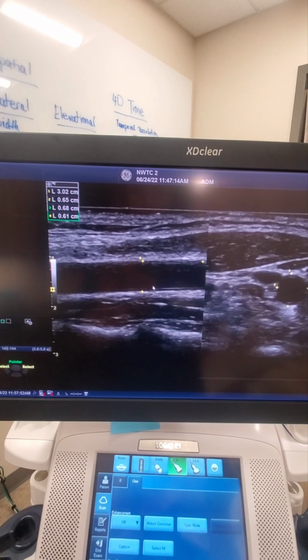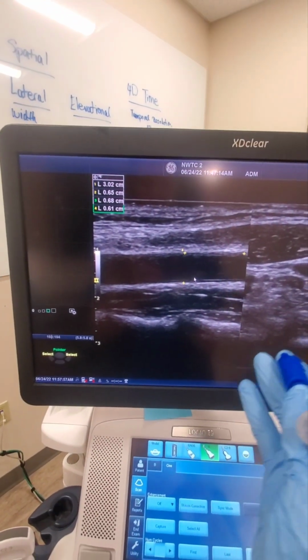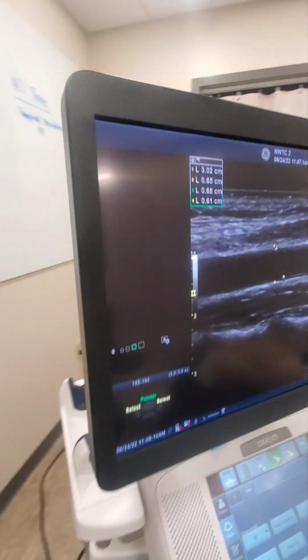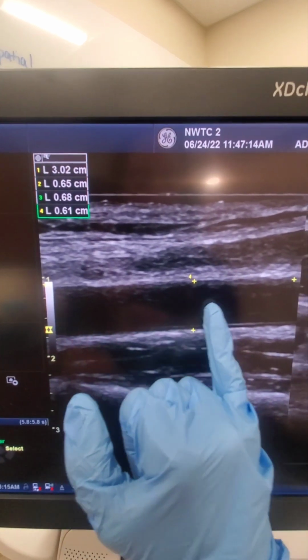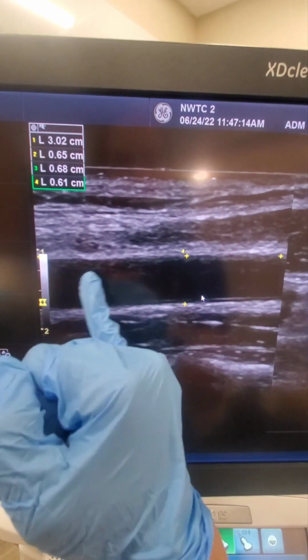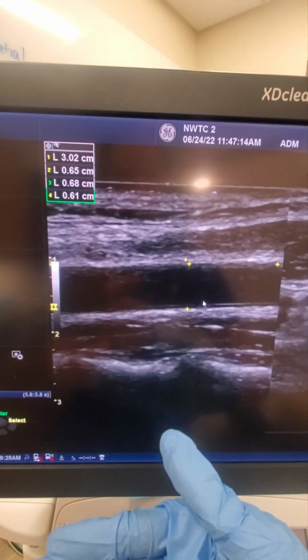But a third dimension exists. It's the dimension I'm not showing. It's the dimension that you can't see. It's the dimension that as I'm scanning is on either side of that slice image. And you can see these echoes in here. It's those echoes that I don't want. Okay? It's artifact. This is showing me the soft tissues that are on either side of my scan plane.